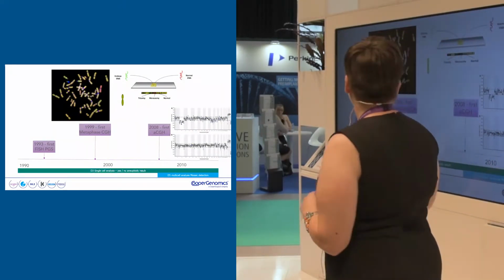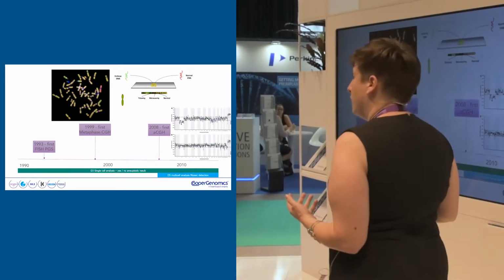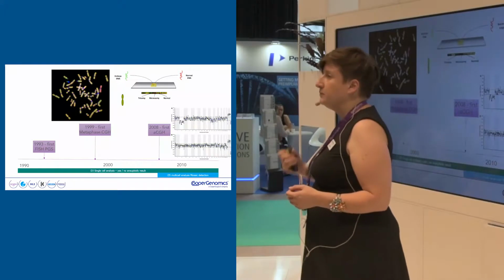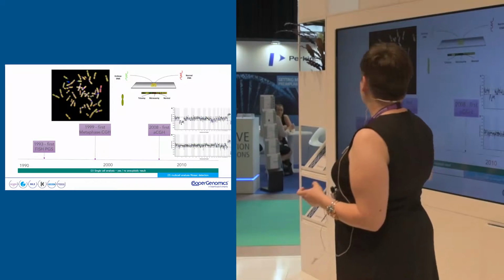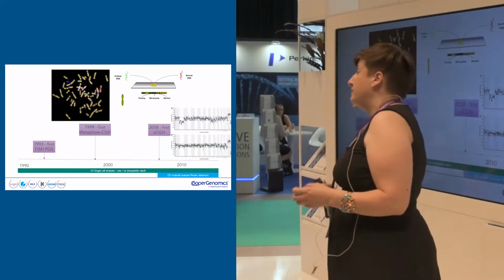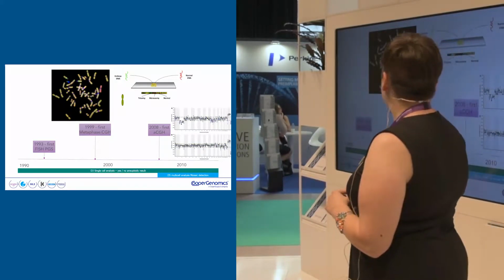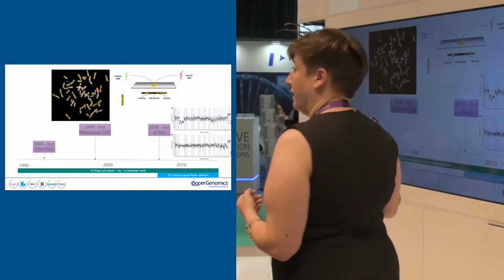So it was a method known as CGH, or Comparative Genomic Hybridization, that allowed us to move to comprehensive chromosome screening. The first technology was called Metaphase CGH, which basically was hybridizing your test material against a normal metaphase. Good idea, but technically difficult and very laborious. And so BlueGnome came up with the 24sure array slide, which allowed us to do this testing in a chip setting.